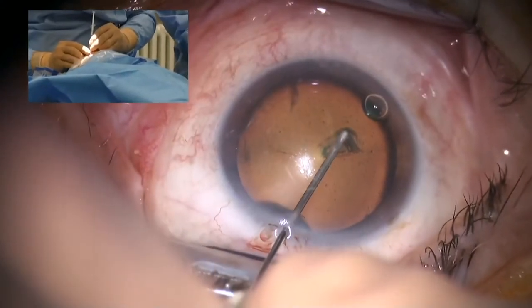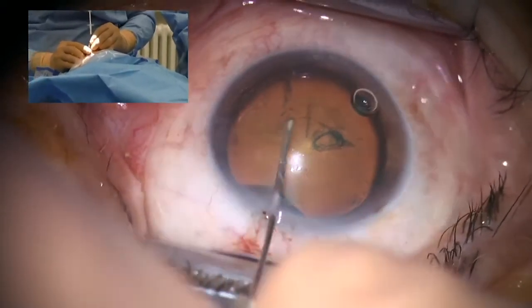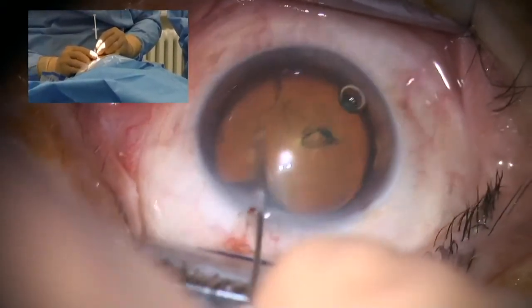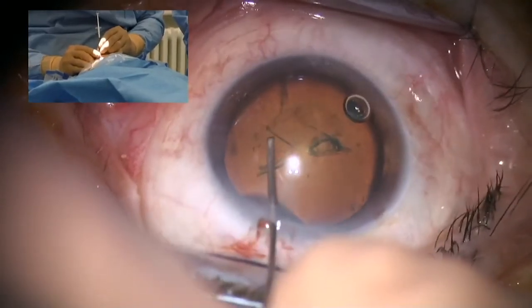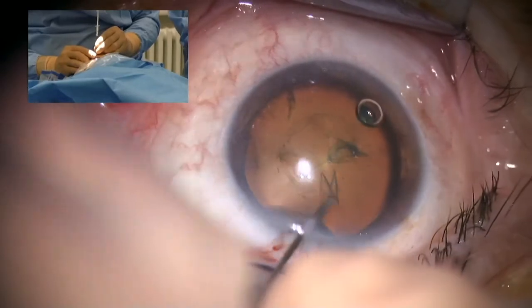I normally use the needle to do the capsulorhexis. You can use from femto laser, as you know, to forceps, whatever you want.